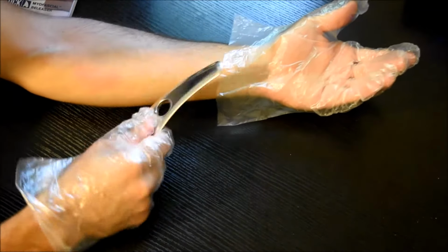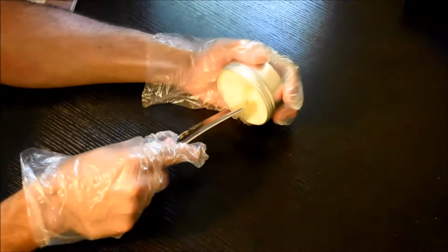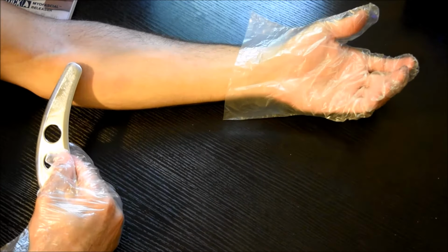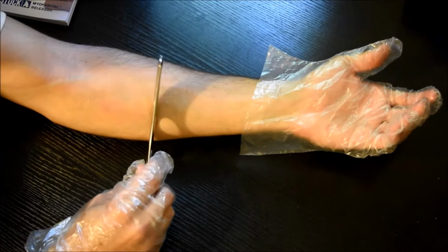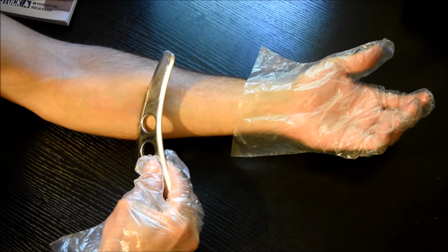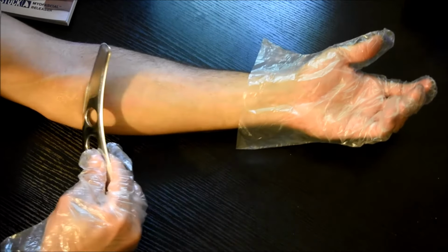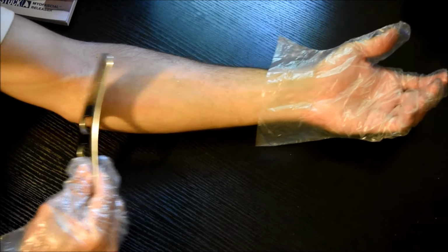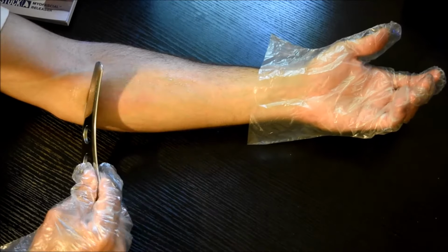First step, you're going to apply some emollient. Our emollient comes with the product. It's solid at room temperature and melts upon contact, and there are a lot of natural ingredients in it. You're always going to stroke distal to proximal, and you're always going to hold the tool at 45 degrees. So if this is 90, this is 45. Distal to proximal, and you're going to perform 20 to 30 strokes per 3-inch area. So I'm going to start with this 3-inch area here, going distal to proximal.